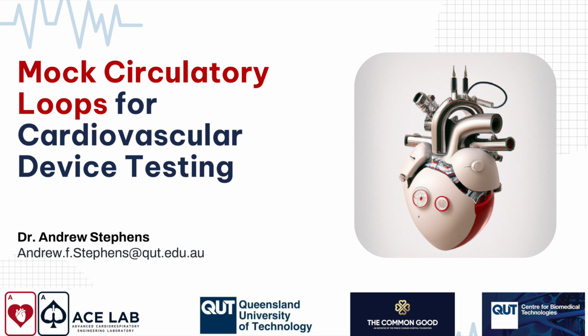Of course, the electrical engineers in the group will recognize that this is just Ohm's law, R equals V on I. So hopefully using this, you can calculate what your resistance is just using pressure and flow. The neat thing is that you can then feed that into a simple PI controller that you can use to automatically regulate vascular resistance.